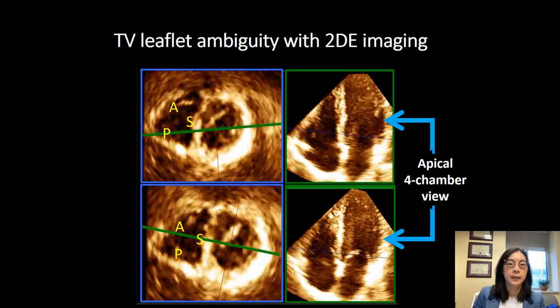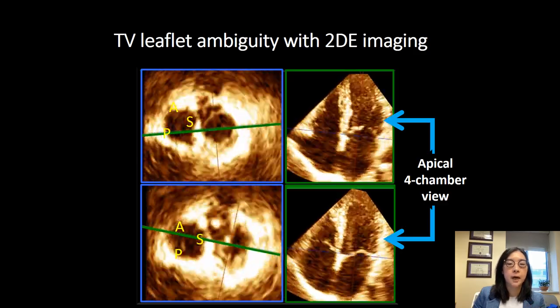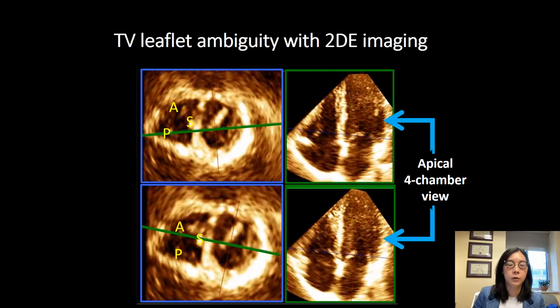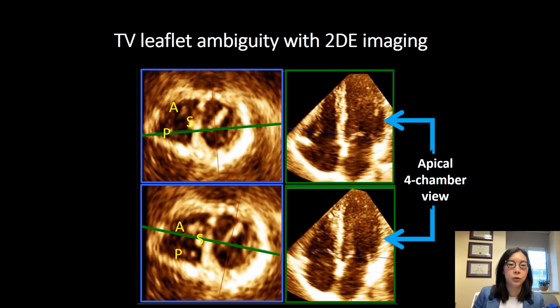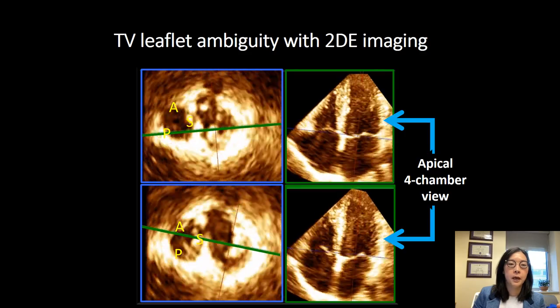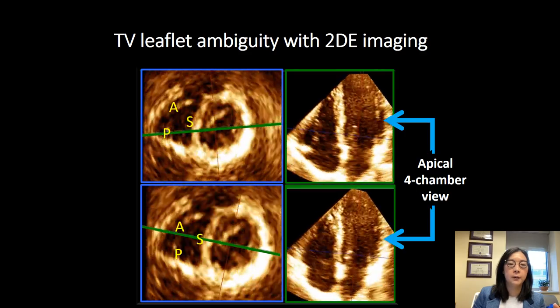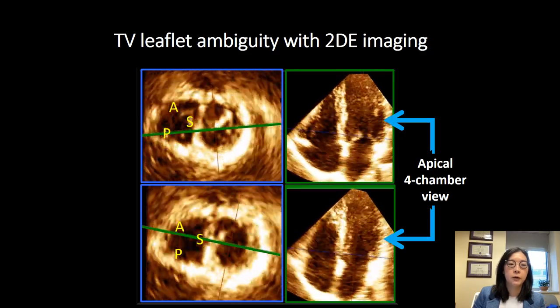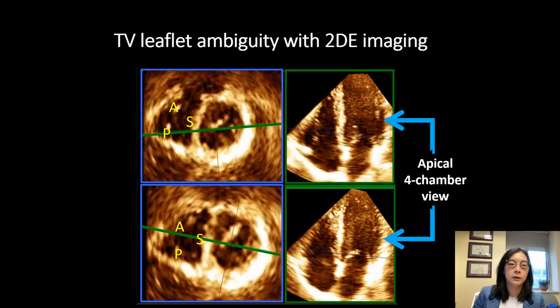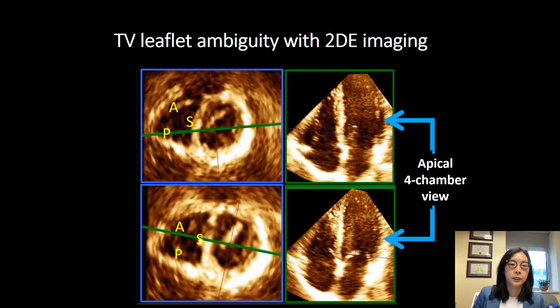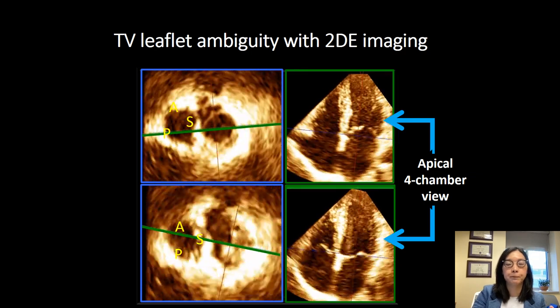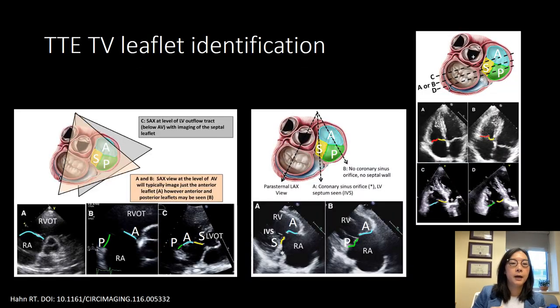Here is a 3D dataset that has been cut to show a four-chamber view. On the top four-chamber view, you're actually cutting through the septal and posterior leaflets, whereas on the bottom four-chamber view, you're actually cutting through the anterior and septal leaflets. In both views, it would be very difficult to identify which leaflet is which. You actually have to look at the structures surrounding the tricuspid valve leaflets to make sure you're identifying it correctly.